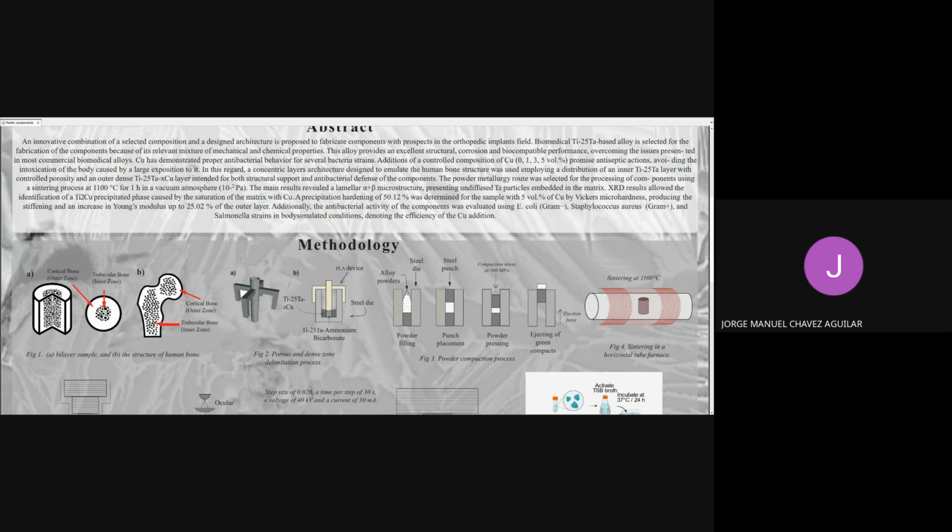the component, fabricated using a titanium 25 tantalum alloy, which has proved very good biological properties and mechanical properties adequate for implants. Also, we use the same alloy with a copper addition. This is with the intention of providing the component with antibacterial activity.